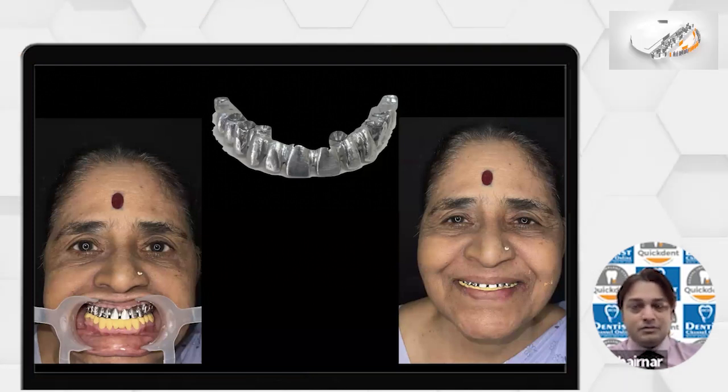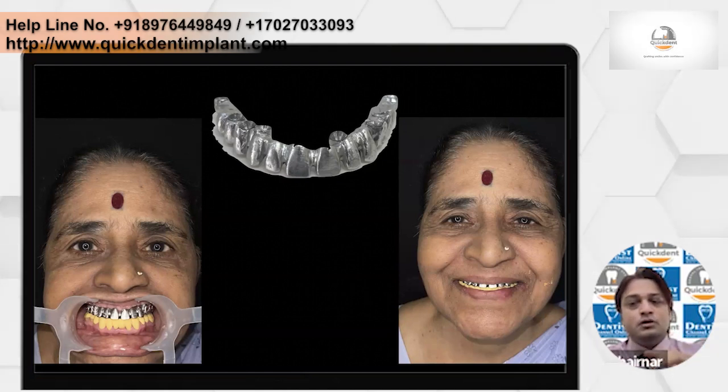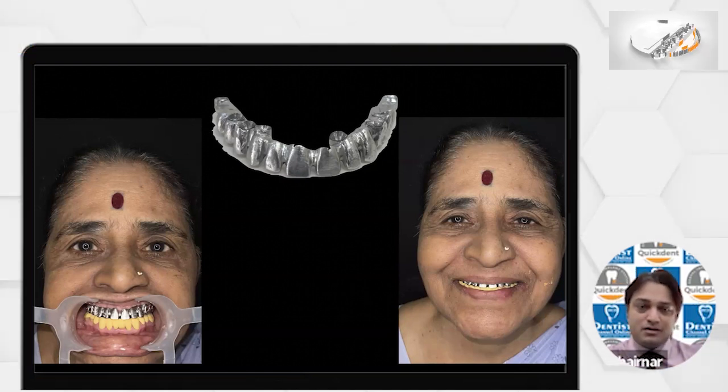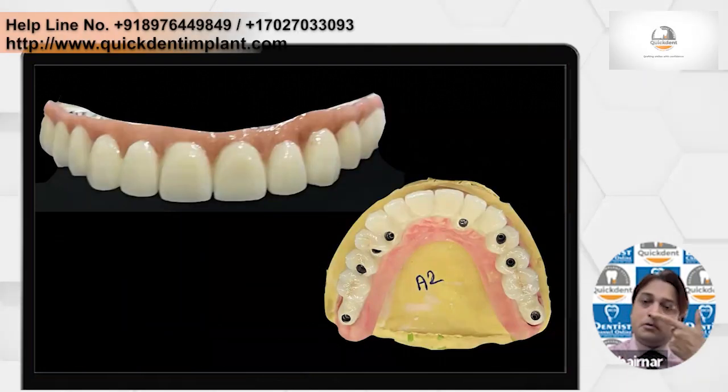Now here, that's where after the metal trial, we'll take a real bite and physical bite, and now we will send, because that's where he has to mount and he has to do the ceramic layering. So metal trial you cannot send without bite. So we send it, and she was having a concern, extra concern about the lip drop.